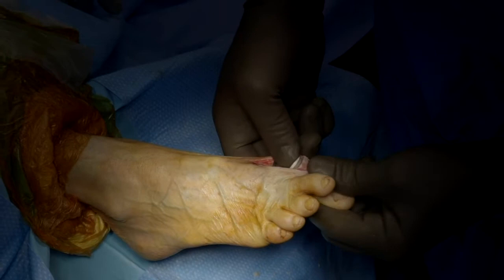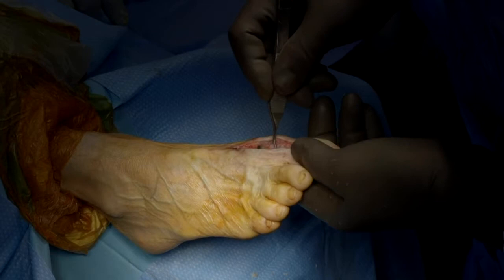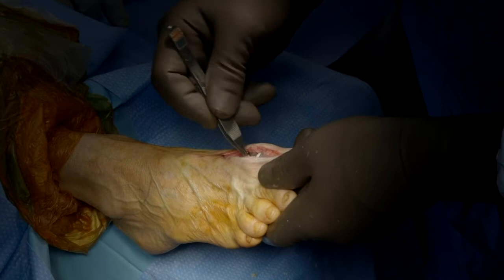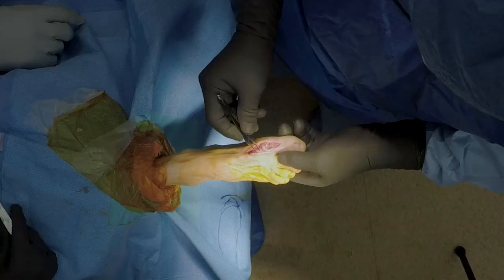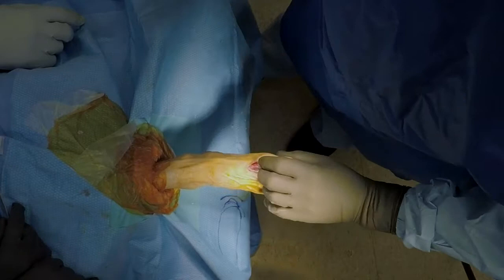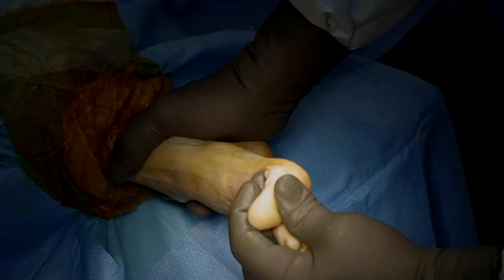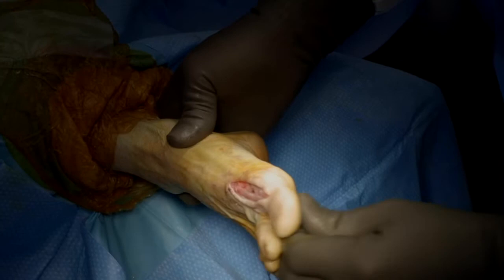Here's her medial capsule that we peeled down, and here's her lateral capsule. I'm making sure that the capsule is not in the way anymore. Then I check my motion — am I stiff, am I not stiff? I want to make sure that when I'm doing her motion I can get her up to 90 degrees easily. I'm noticing she's a little tight and I have to figure out: is it because of soft tissues, or do I need to decompress?